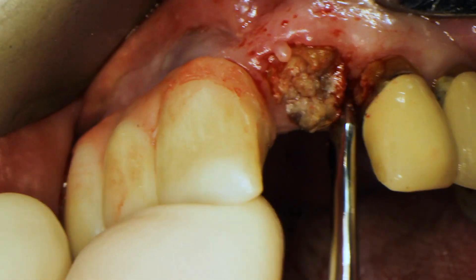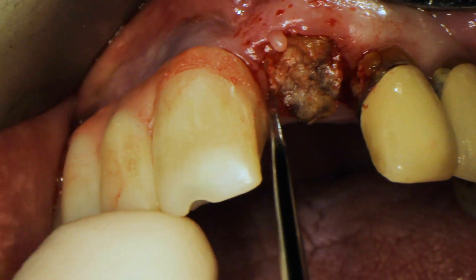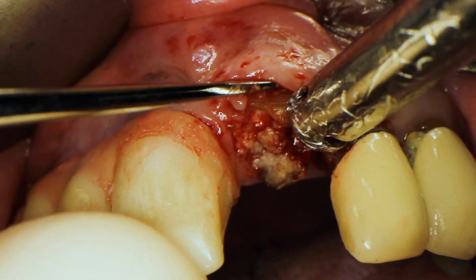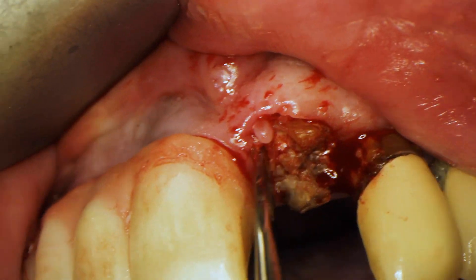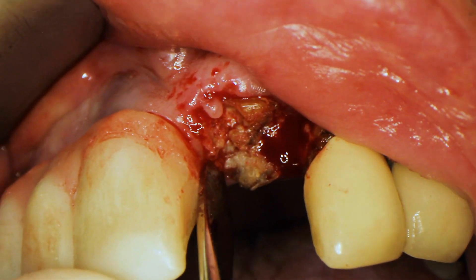I'm using a periosteal elevator to go around this little root tip that remains, just to loosen the soft tissue. I'm also applying a little bit of pressure to try to dislodge this root tip. It's looking pretty loose.